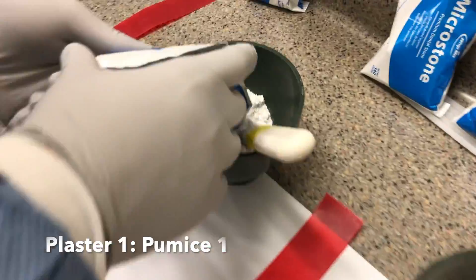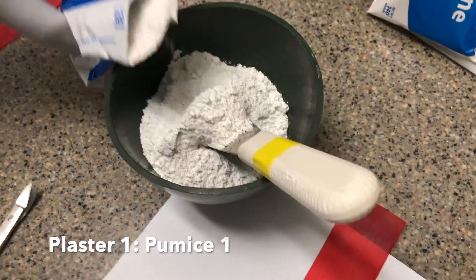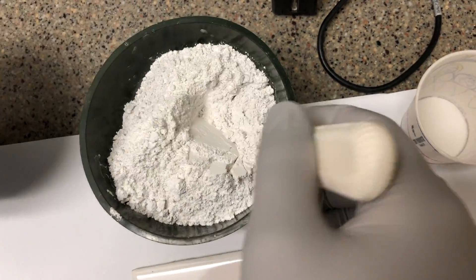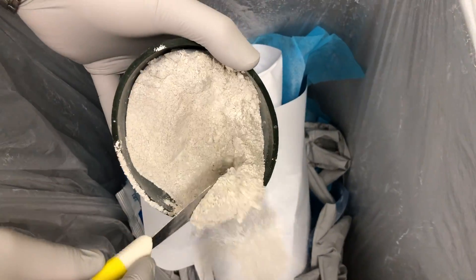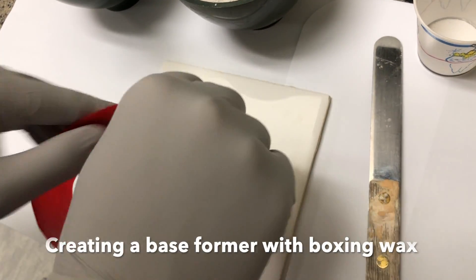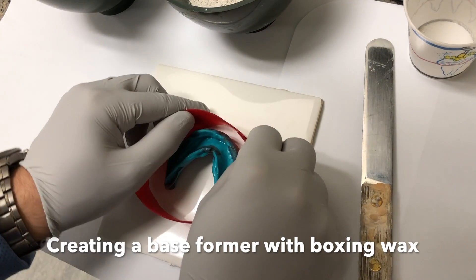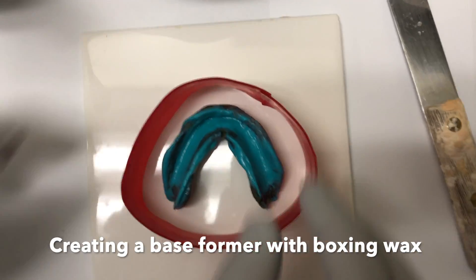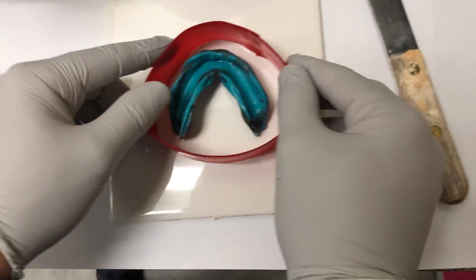Mix the plaster and pumice to a 1 to 1 ratio. Using boxing wax, create a base former for the plaster and pumice around the impression. Make sure there is a 1 cm space between the former and the impression.